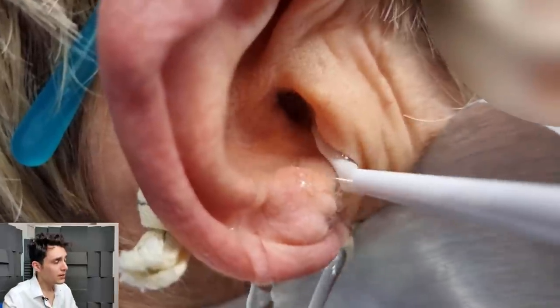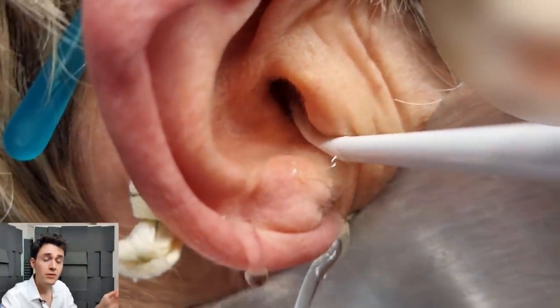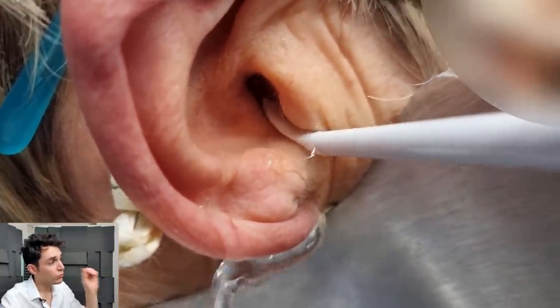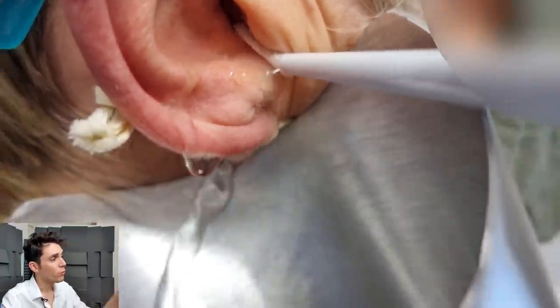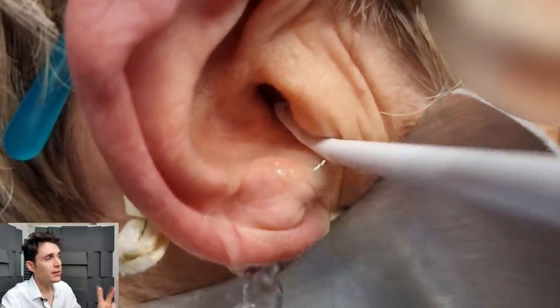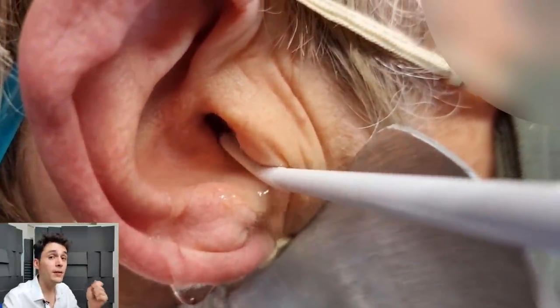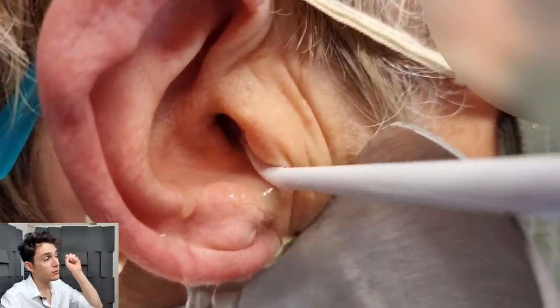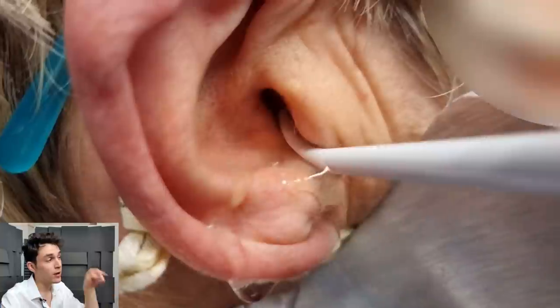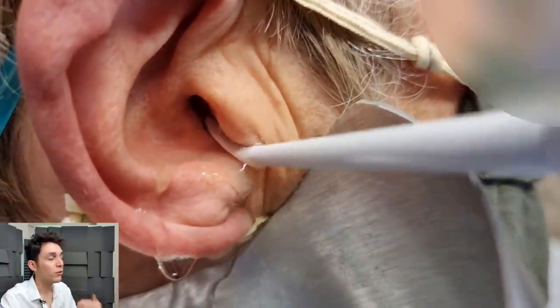There are three things to note here. First, I'm not shoving this in really far — you're not supposed to. It just lies at the entrance of the ear canal and shoots water in pulses. I've got this on the lowest setting, which is more than enough. We're using water at about 37 degrees Celsius. Second, notice how the little stick is curved upwards — that's how it's meant to be used. The jet of water is not aimed directly down the canal at the eardrum; it's aimed upwards at the roof of the ear canal, and then it washes down and clears debris gently. We don't want a lot of pressure hitting the drum.